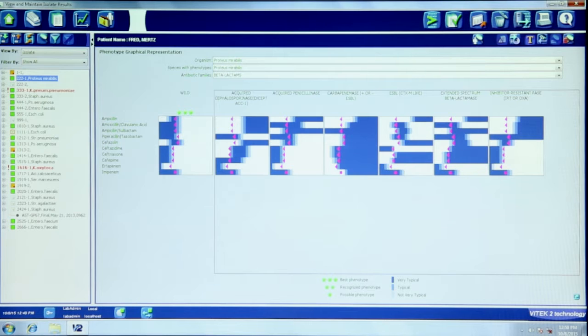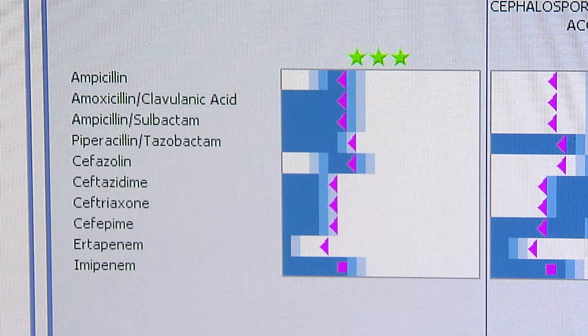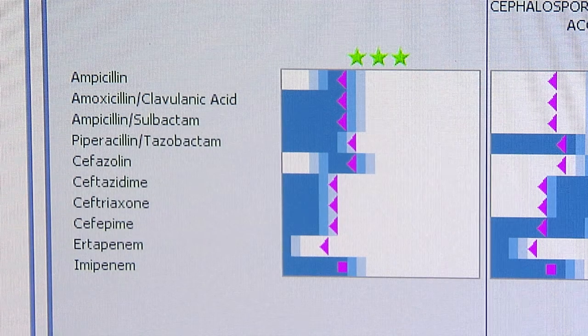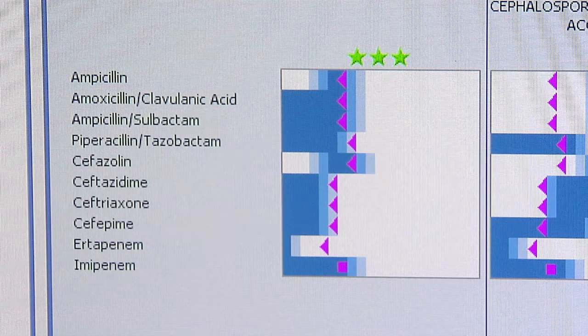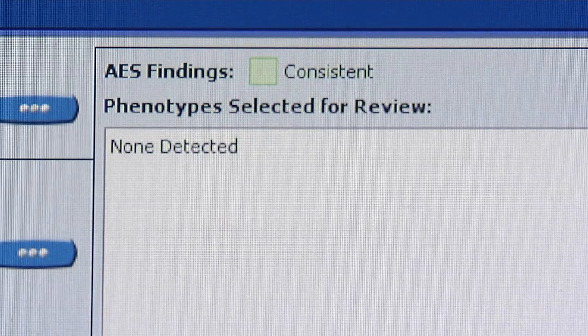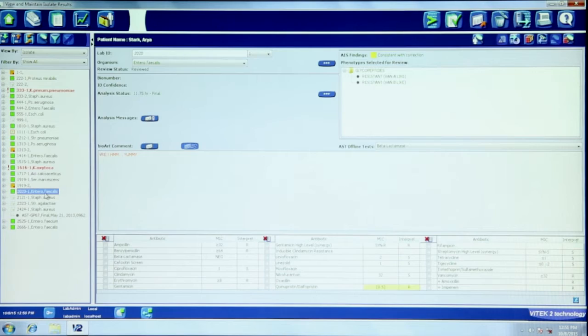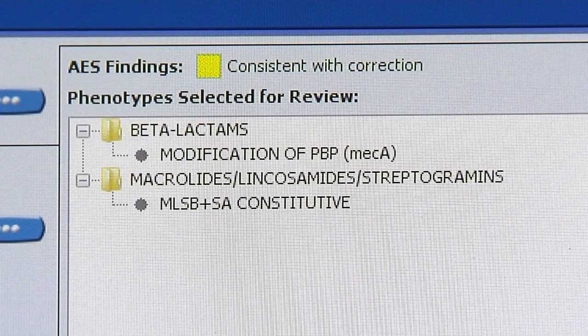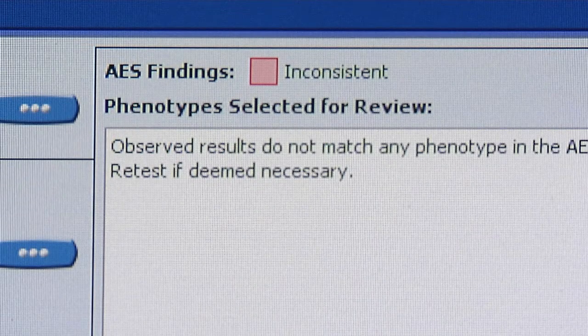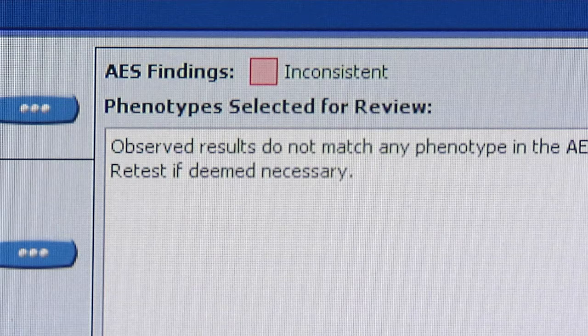The Vitek 2 Advanced Expert System AES software is used to validate the susceptibility test results obtained from the instrument. During the validation process, AES attempts to find a match between the tested results and a collection of phenotypes in the knowledge base. When a perfect match is found, AES displays a green confidence level icon of consistent. For those isolates that are not a perfect phenotype match, AES displays a confidence level icon of consistent with correction or inconsistent. This video will address the inconsistent confidence level icon.